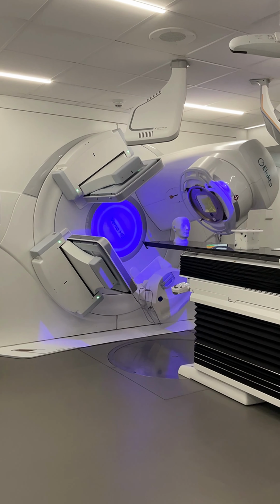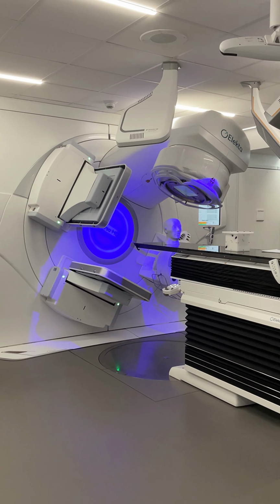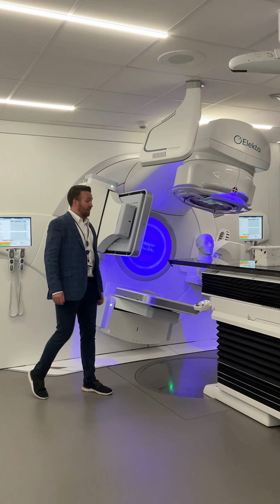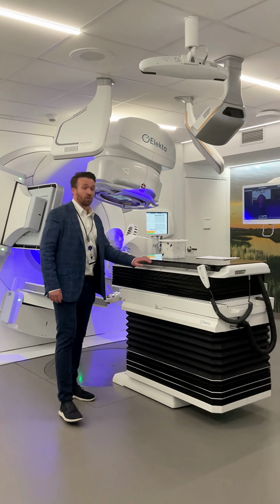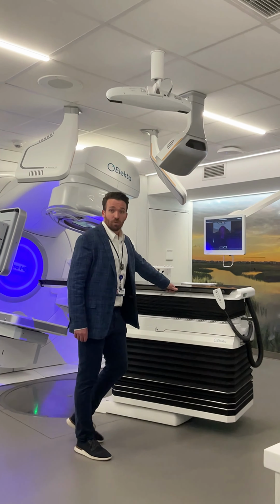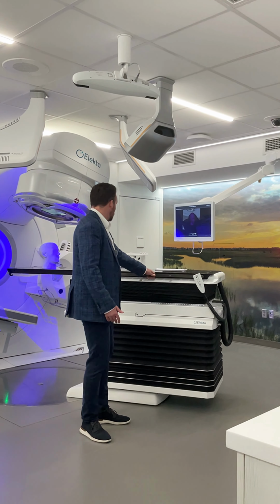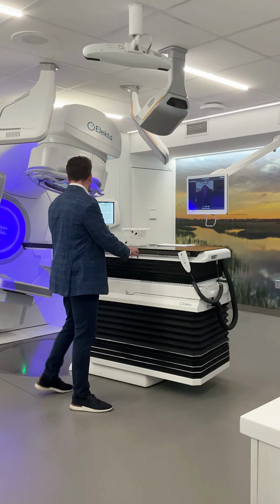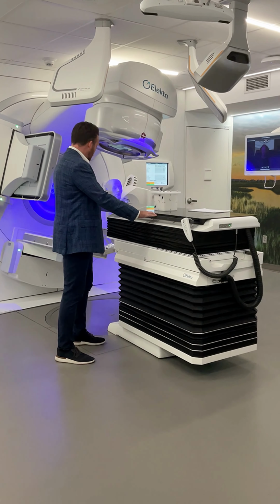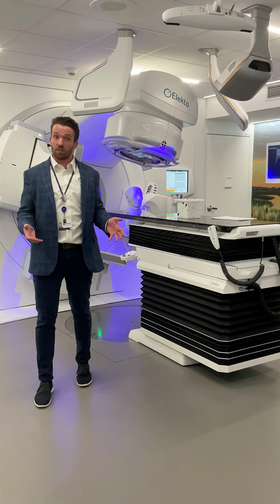Now, not only can this gantry move a full 360 degrees around the patient, but if we need a little bit more wiggle room than that, the table itself is also able to rotate. And so we can treat this patient from any angle and any position. And so this allows us to further minimize any damage to the healthy tissue that is around the tumor cell. Now, when a patient first gets in here for treatment, we're going to set them up in the exact position that we had when we simulated them to create the treatment plan.